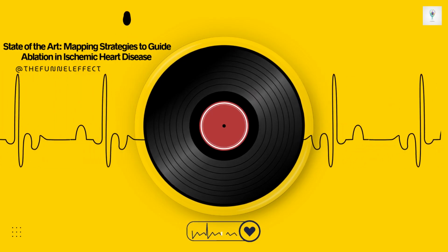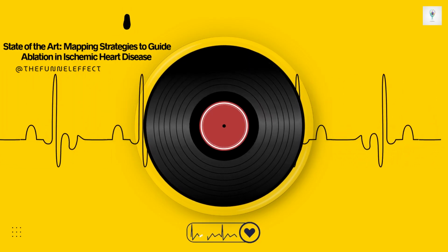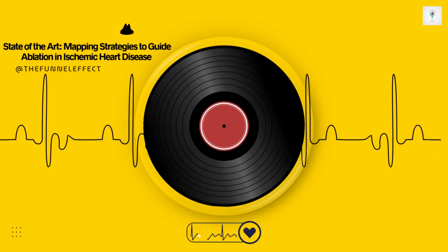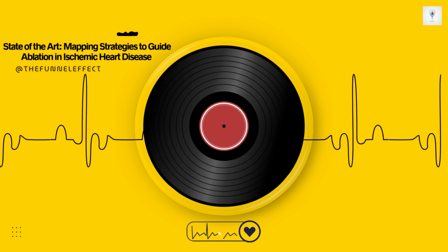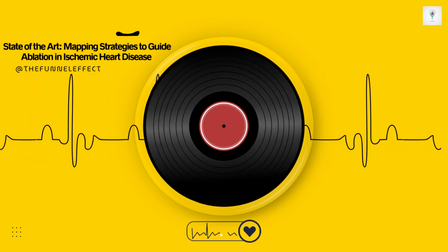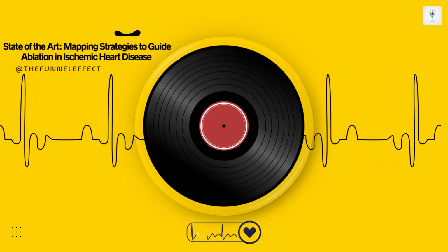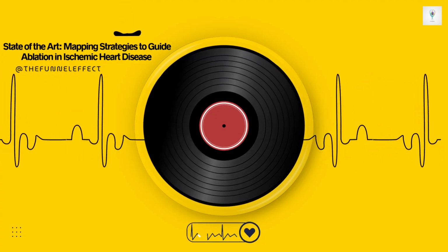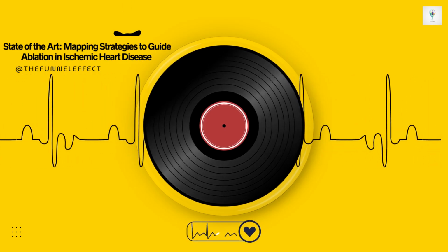If the patient becomes unstable or the procedure is dragging on, becoming very long and complex, the operator might have to make a judgment call. Maybe focus only on the VTs that look exactly like the ones stored in the patient's ICD. Or in really high-risk situations, they might even decide to skip VT induction altogether and rely entirely on substrate mapping. It's always this clinical balancing act driven by patient safety.